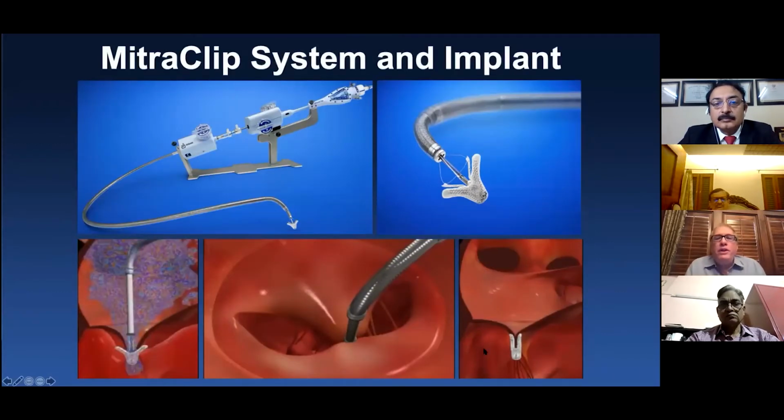So now we bring in the MitraClip, and you're all very familiar with this. This does, with a transcatheter clip from a transseptal venous approach, clip the anterior and posterior mitral leaflets together, and it creates this double orifice or bow tie repair, which was based on the original Alfieri stitch, a surgical technique developed by Ottavio Alfieri in Milan.